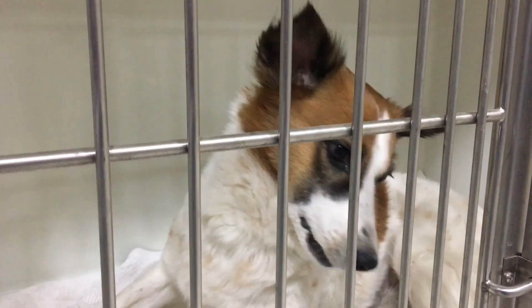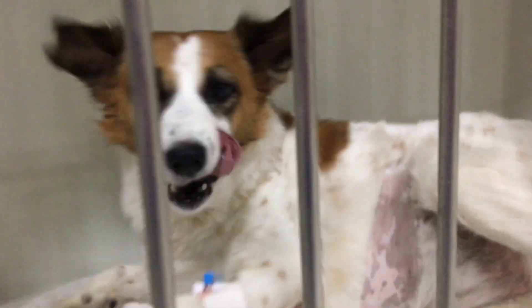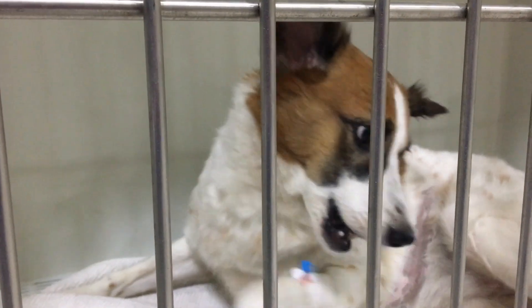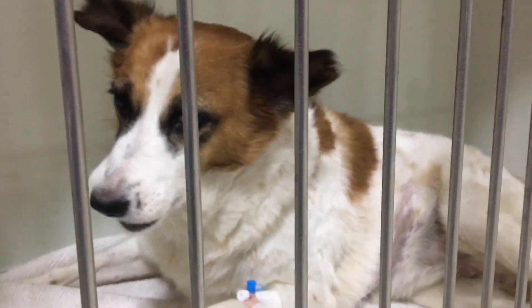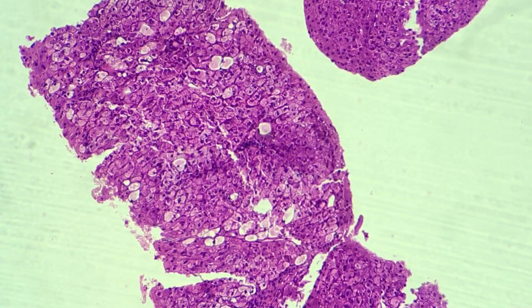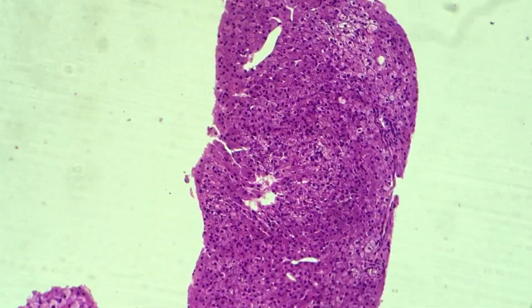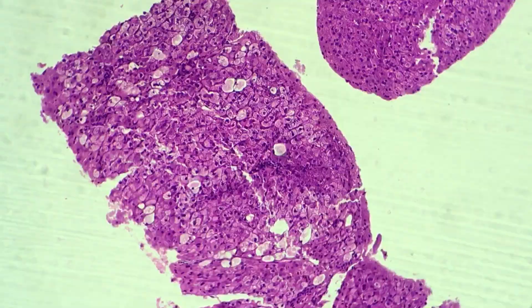Meanwhile, the patient recovered very well. We administered all pain medications and fluid therapy, and the patient did not experience much pain. Once he completely recovered, we sent him home with his owners. This is our sample under microscopy — as you can see it is a small part of the liver.